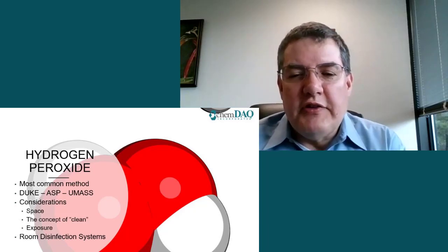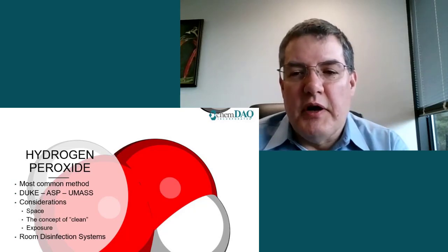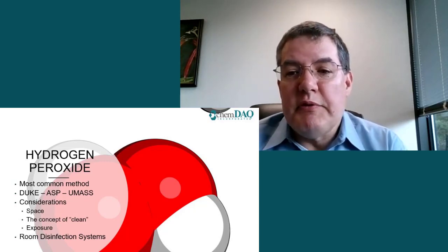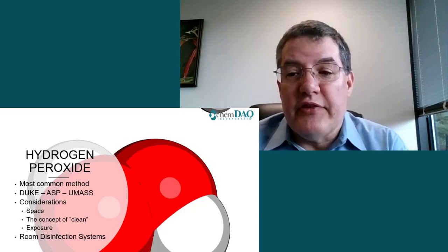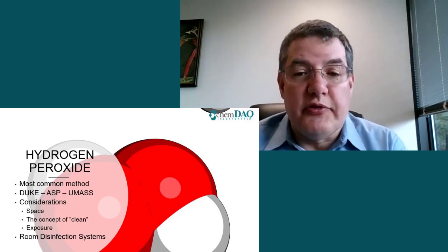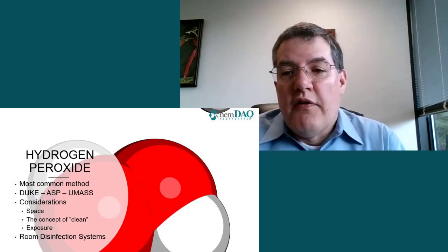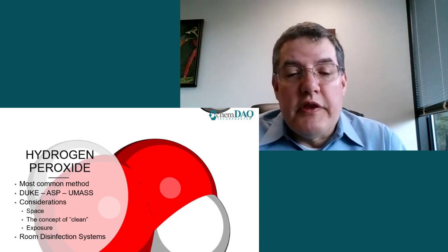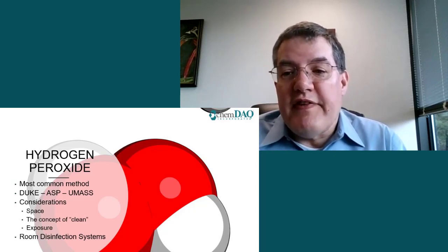The FDA has granted Steris an emergency use authorization to use its VPRO sterilizers to sterilize N95 masks. And ASP has a qualified protocol for reprocessing masks in its Sterrad sterilizers. Hospitals using the Sterrad system can reprocess up to 480 masks per machine per day. Assuming they're using the 28-minute cycle, that works out to only 10 masks per cycle. 3M has also verified the continued fit and filter efficiency for masks sterilized by both ASP Sterrad and Steris VPRO sterilizers, confirming the findings from the University of Massachusetts and New England Baptist hospitals that the N95 masks were still effective at blocking infectious particles after sterilization.